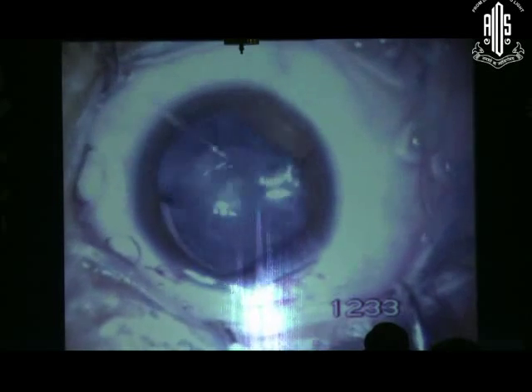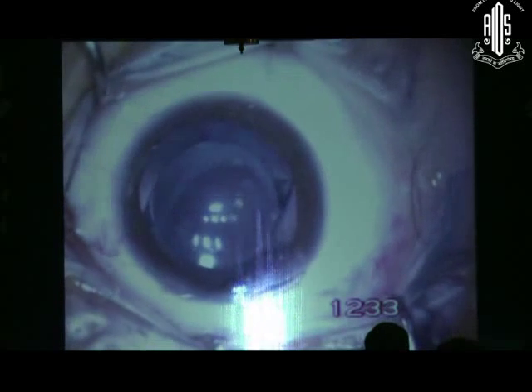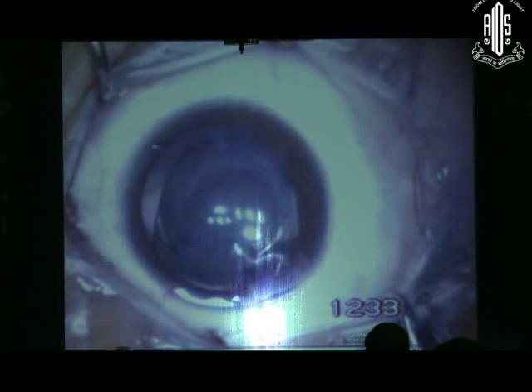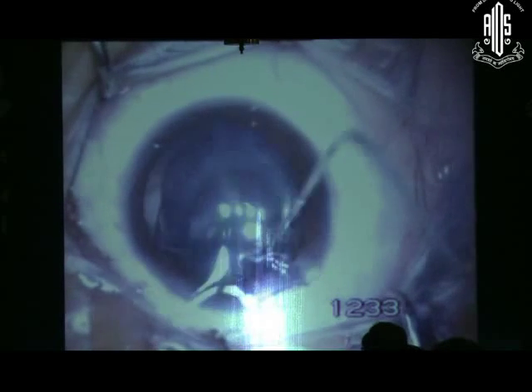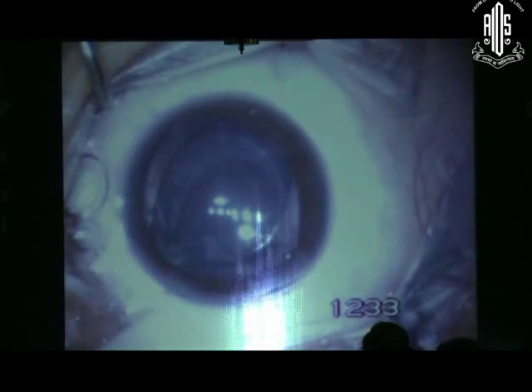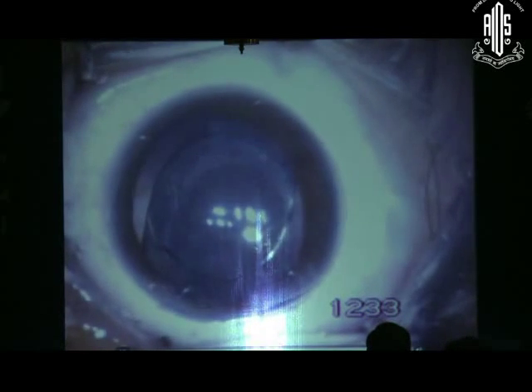So anyway, you have to just maneuver and take out the lens from this, and because the rhexis is extended, we tried to keep it in the bag with a pupillary optic capture, but it wasn't working. So at the end of the procedure, we just brought it out. As was said earlier, I fully believe that if you were to put a lens in the sulcus, it should be a 3-piece lens, but this would have been much more problematic because we were not expecting any problem in putting the lens in the bag. So this is how the case ended.